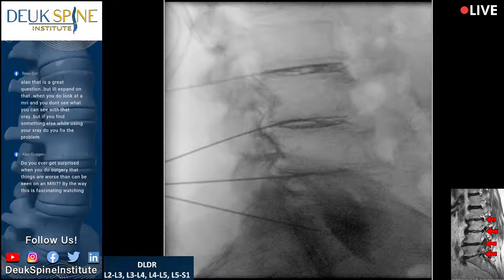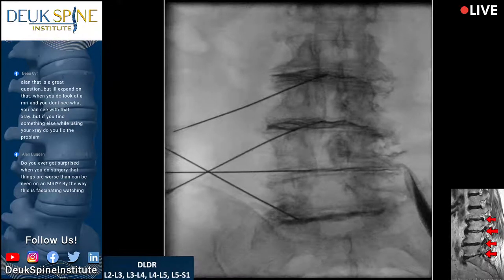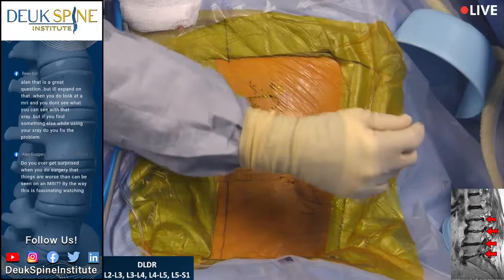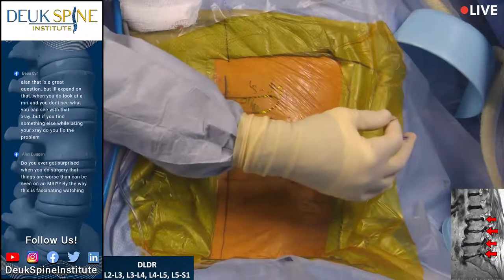All right, great. So for those of you watching, we just tested all four discs that we plan to treat today. So just to recap, people with chronic back pain, there's different causes of that pain. And the most common cause by far is an annular tear, a tear in the back of the disc called the posterior annular tear. Oh, you can see the dye going down the nerve root on that side. That's so cool. It's on the outside of the nerve root, and that would be the L4 nerve root on the left.